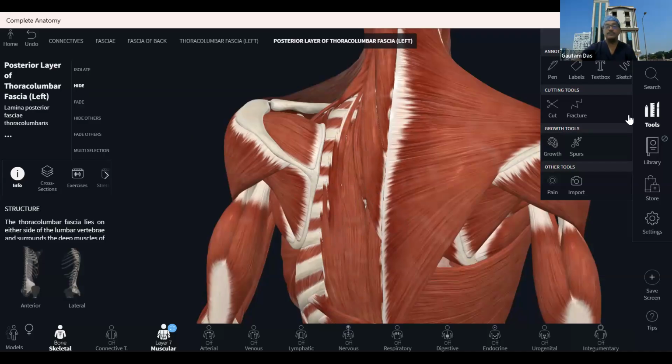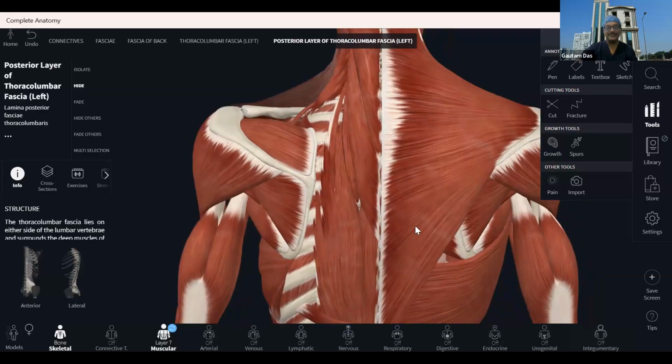Okay, now let us go for the demonstration. Yeah. Do you want to say anything? Yes, tell. Is anybody telling anything? Okay, now let us go for the demonstration.